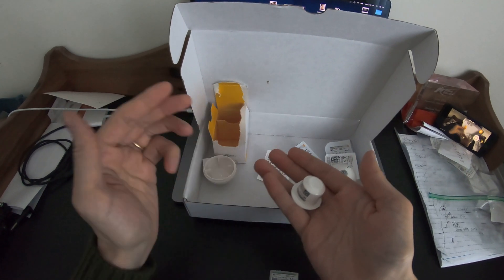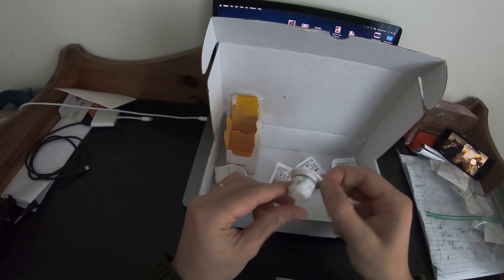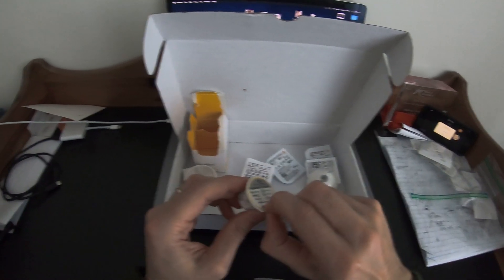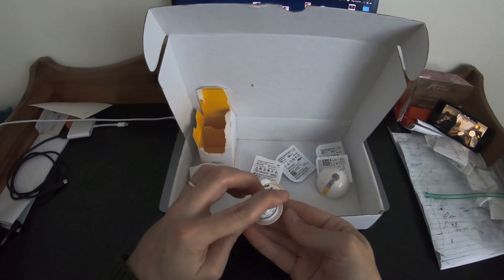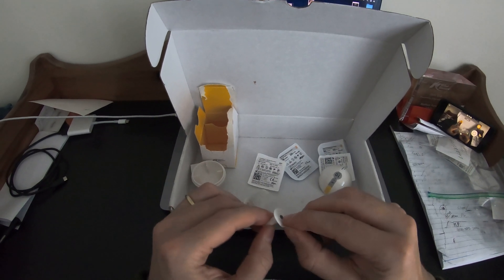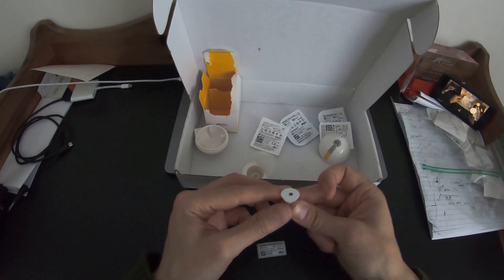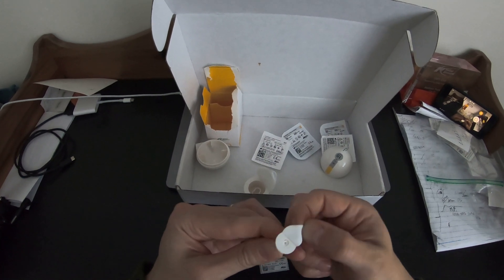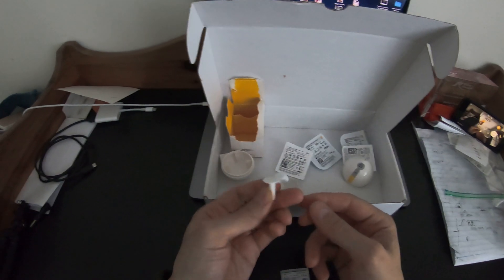Dump onto the back table. Apparently we and Keurig share the same packaging — straightforward, easy labeling. This gets dumped out into the sterile field. Peel that back and it exposes the connection to the implant. Take your driver, place it, pick it up — done. I like the packaging, easy to handle.